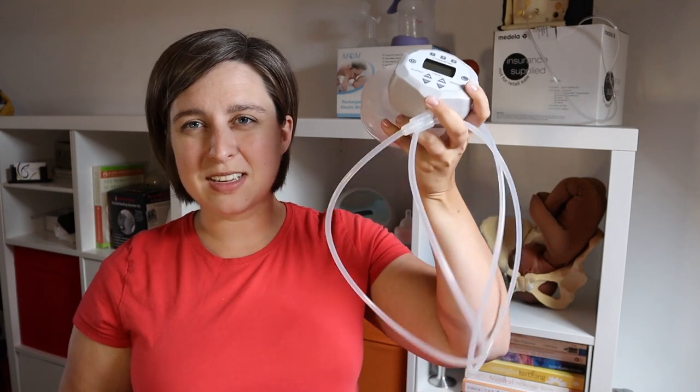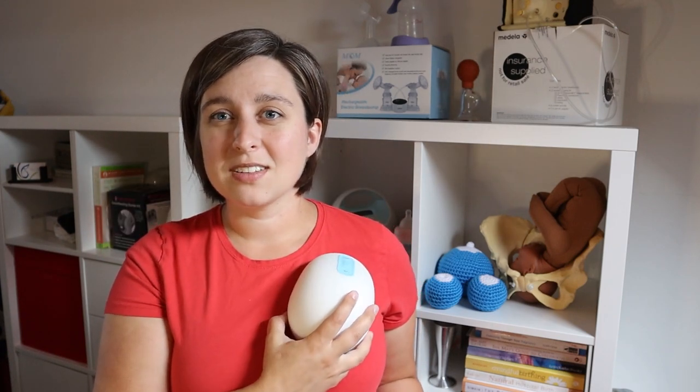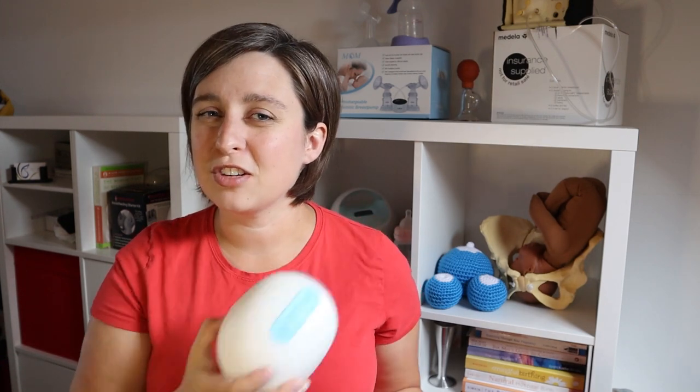Next let's talk about convenience. You can see that there is still some tubing and some logistics that you're going to have to work with with the Free Me. The Willow pump — that's the entire thing. You stick it right on the breast, there's no tubing, there's nothing. So this is definitely a little bit easier to use. You can find ways to make the Free Me work — run the tubing under your shirt, clip the little pump onto your waistband — and it still works pretty well.